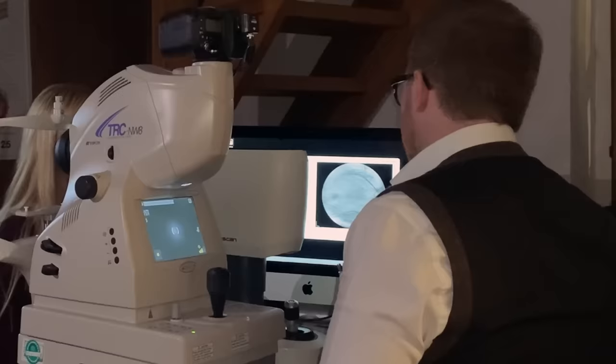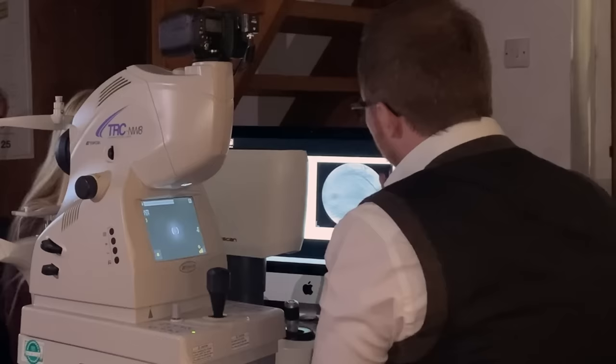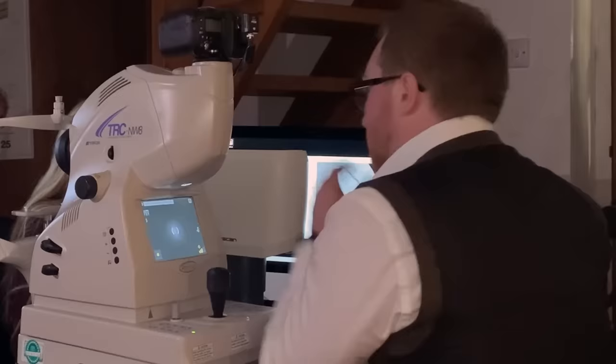So we've got a nice black and white image because it's made from a composite laser image. We've got the optic nerve, this little blob over to the side here. I can zoom in on that for you. So that's where our natural blind spot is. We'll see it a little bit clearer on the photograph.